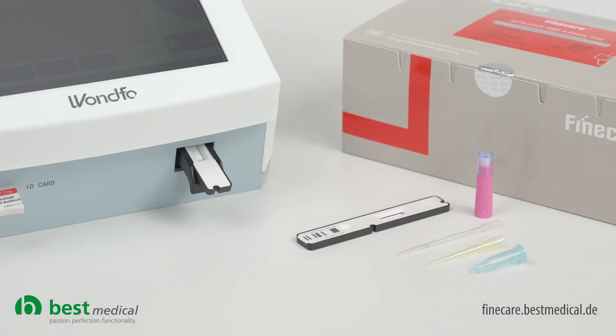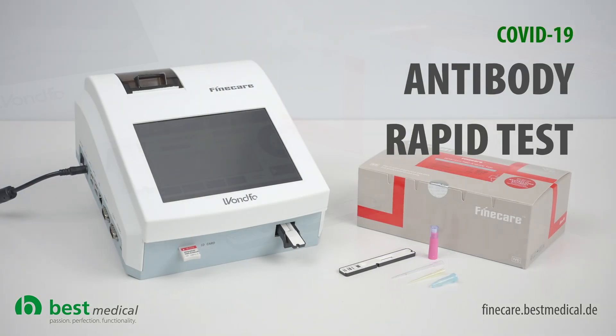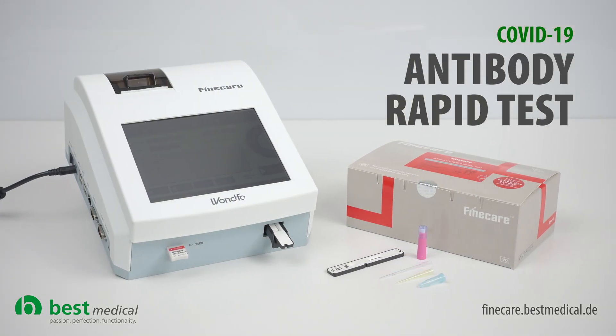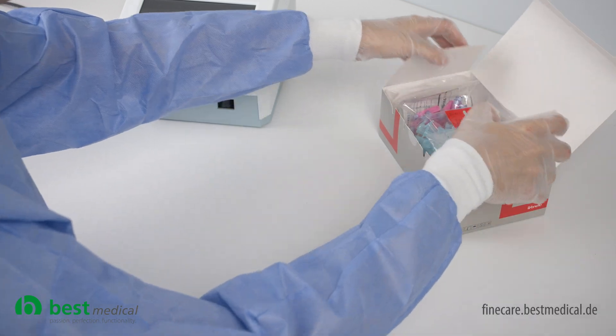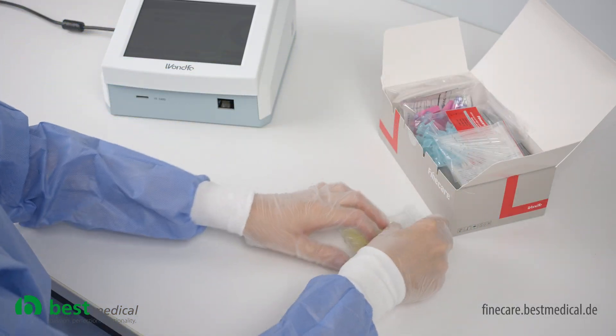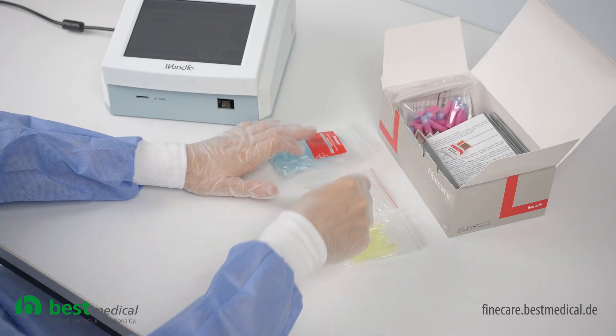With our FineCare COVID-19 antibody test, you receive all the components to perform a test directly at your site. To obtain a meaningful test result, a room temperature between 10 and 30 degrees Celsius must be ensured. Allow the test items to acclimatize first.